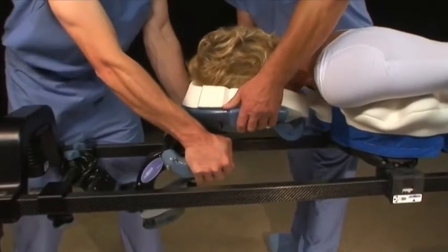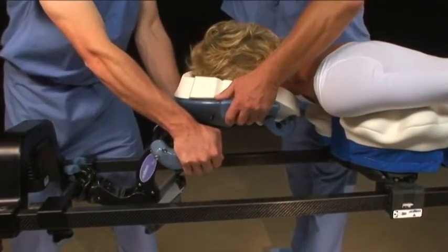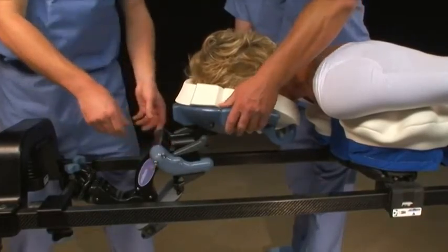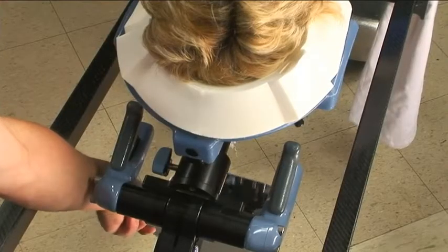Someone should always guide the head during adjustment. After adjustment, apply light pressure to the C-flex to ensure that it is locked. Adjust the twin mirrors to view the patient's face.